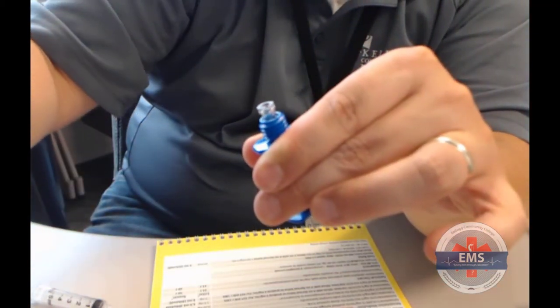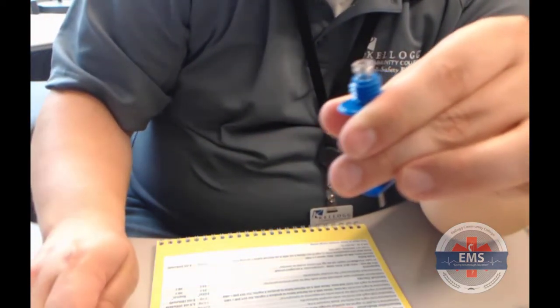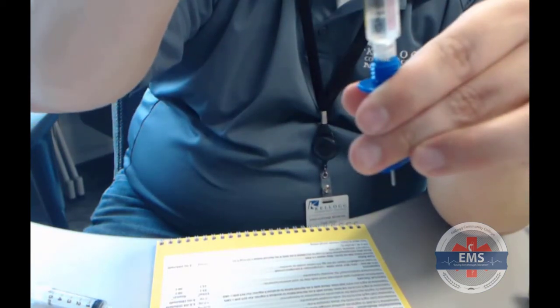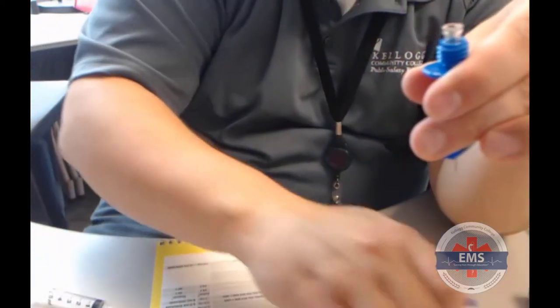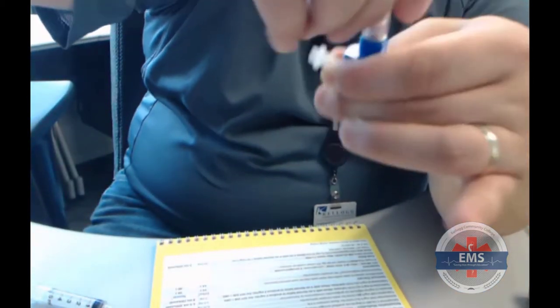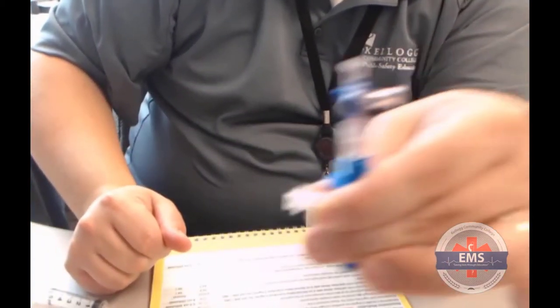That's a sharp. Sharps go directly to the sharps box. And now I can take my syringe and connect it directly onto here, and then either aspirate or inject fluid. I can also hook up a stopcock to this if I feel that it's necessary, just like so. So I can have another place for medications to be administered to control a bit more fluid as far as that goes.